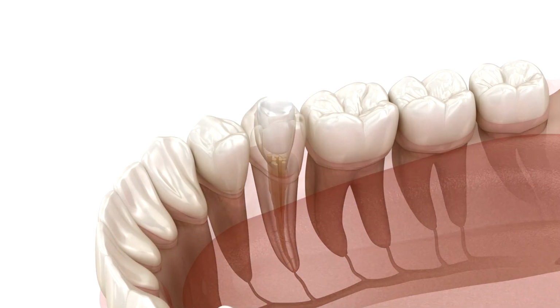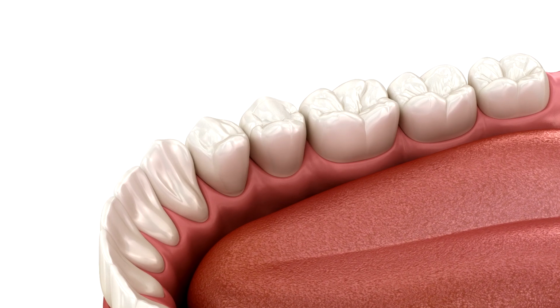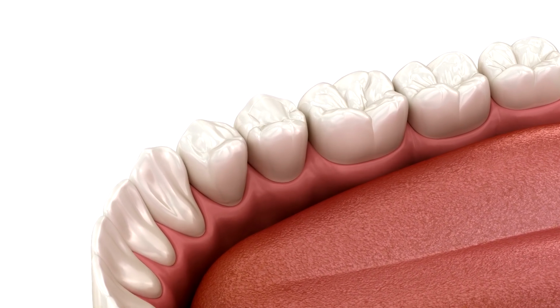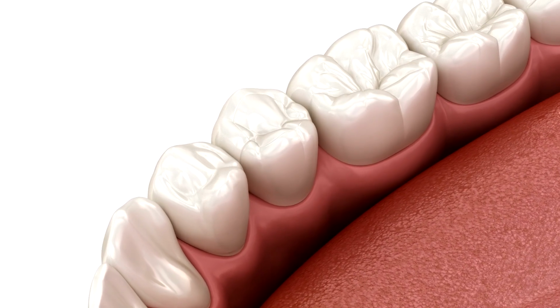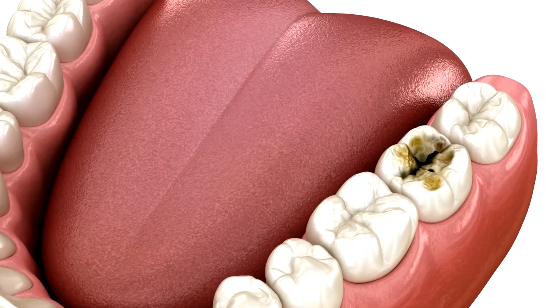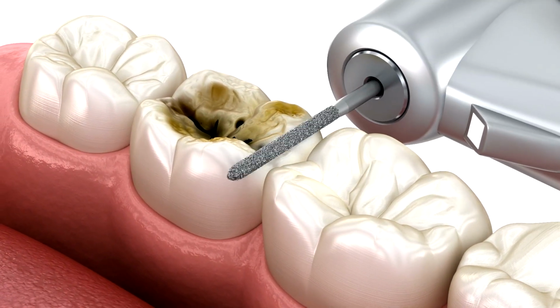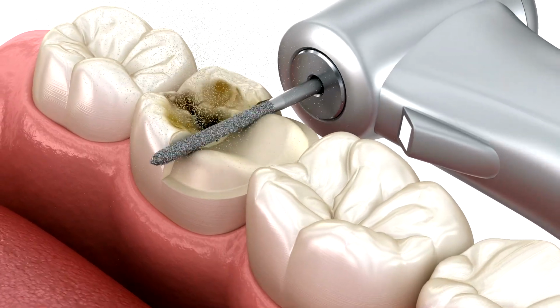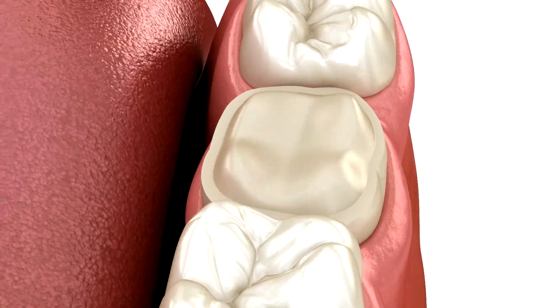In some cases, this whole process can even be done digitally with CAD/CAM technology like CEREC, where a 3D scan is taken and a custom ceramic restoration is milled right in the office. This allows for a complete, super strong ceramic filling in just one visit. This journey from a microscopic acid attack to a beautiful, high-tech restoration uncovers a hidden world inside our mouths.